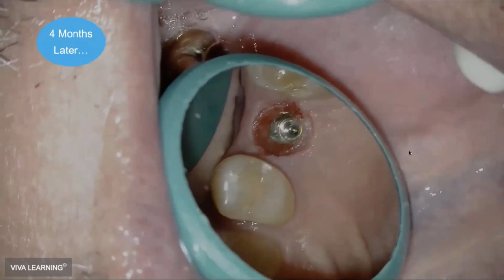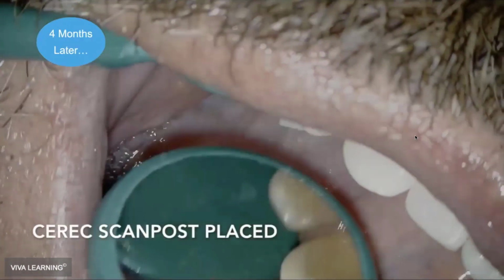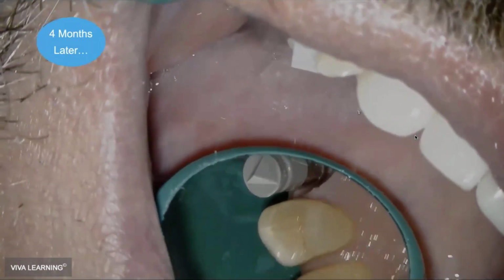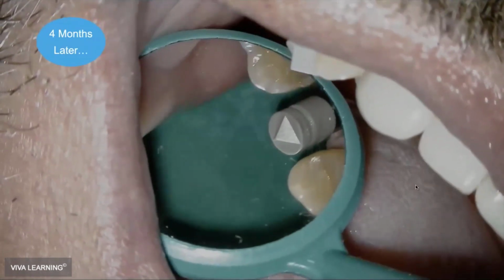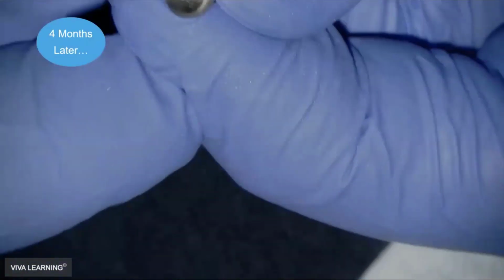Very minimal bleeding. It looks a little red and irritated in there, but it's not bleeding all over the place. So we're going to place our scan post in the CEREC world. That's what we call it. And then we're going to image that and place a crown a few days later. We'll go ahead and fast forward a little bit.